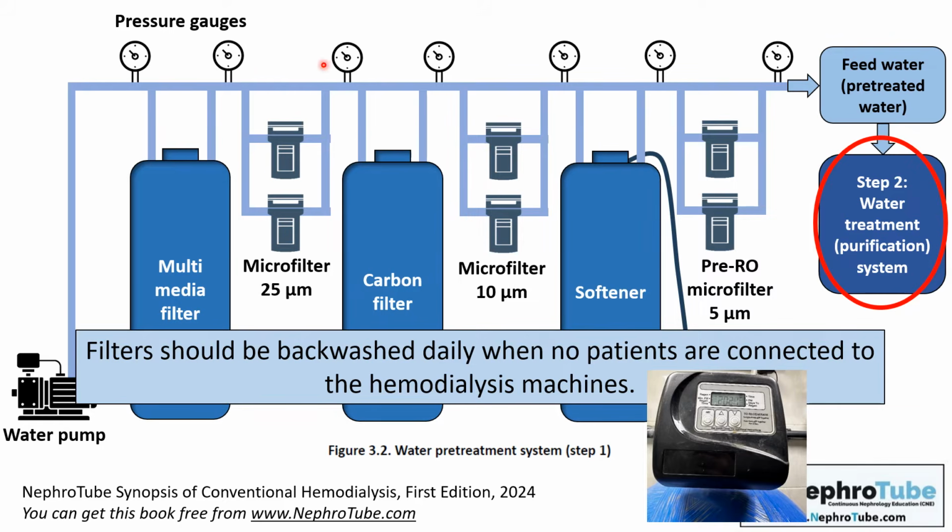If the pressure in these pressure monitors decreased or went down, although the flow is good within the tank, this means that this tank or filter lost its integrity. It is not working well because the pressure becomes low, although the flow is going through it. So this tank lost its integrity.